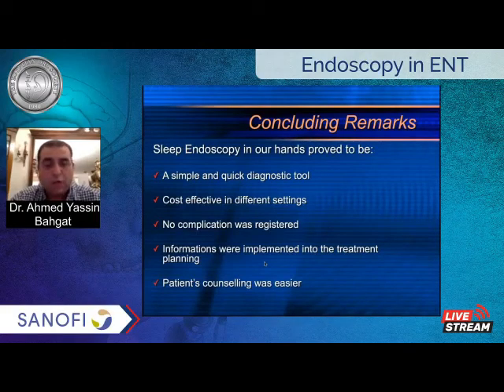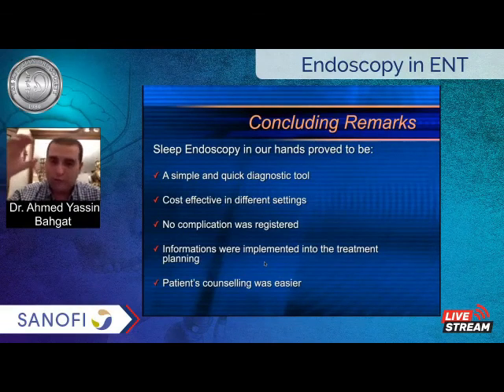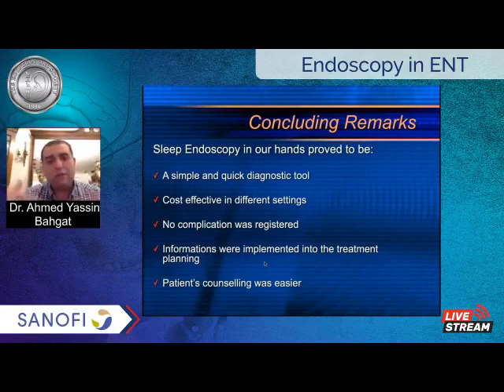So sleep endoscopy is not just putting a flexible endoscope into the patient and just looking at what's going on. No, you need to know how to set up the patient, how to induce sleep, how to know that you are in a proper stage of sedation to judge the airway, and what you are looking for.